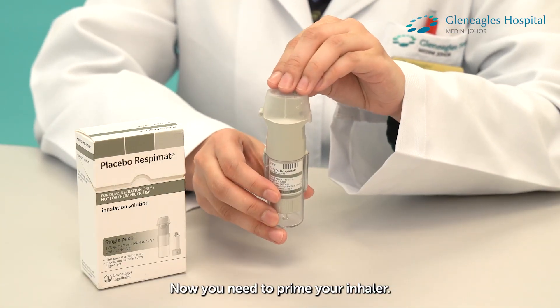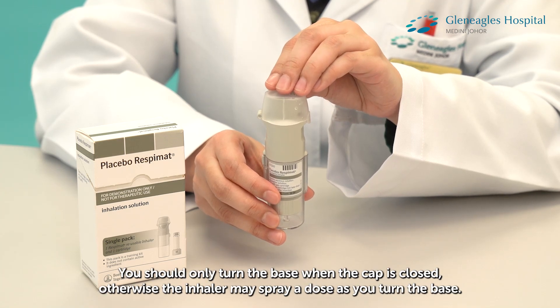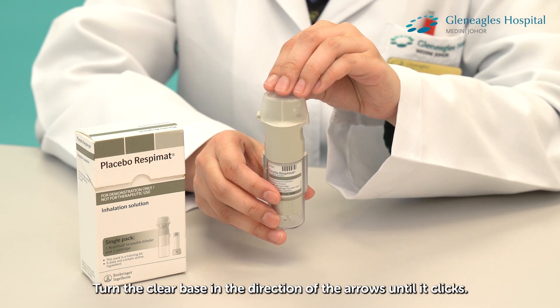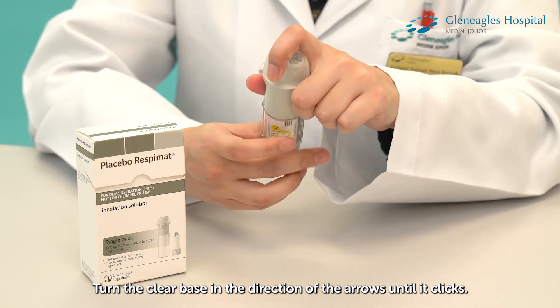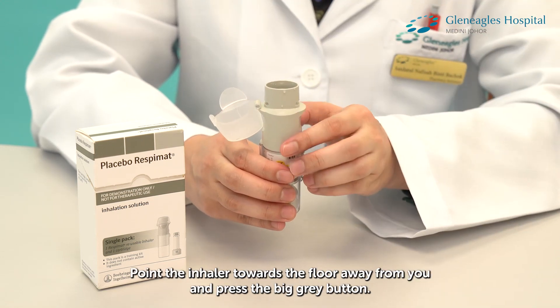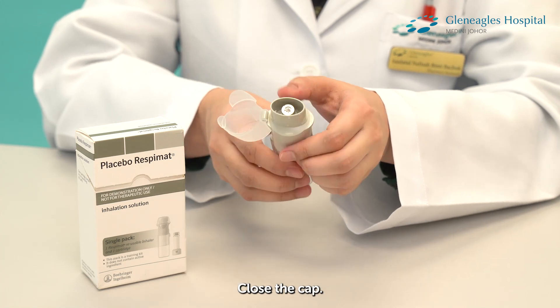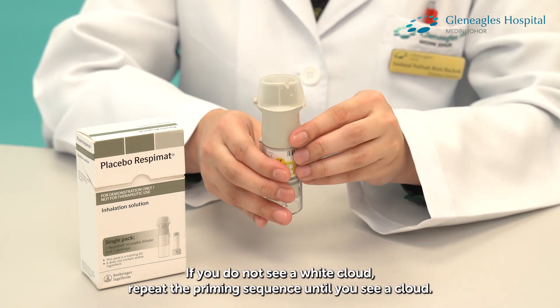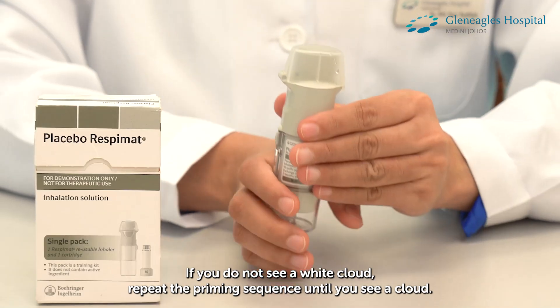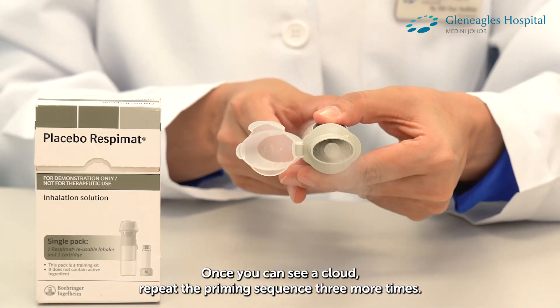Now you need to prime your inhaler. Hold your inhaler upright with the cap closed. You should only turn the base when the cap is closed, otherwise the inhaler may spray a dose as you turn the base. Turn the clear base in the direction of the arrows until it clicks. Open the cap fully. Point the inhaler towards the floor away from you and press the big grey button. Close the cap. If you do not see a white cloud, repeat the priming sequence until you see a cloud. Once you can see a cloud, repeat the priming sequence 3 more times.